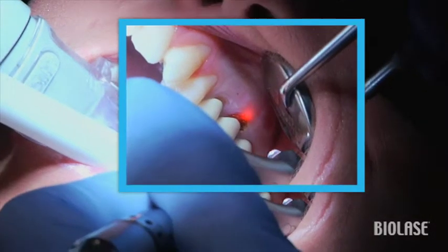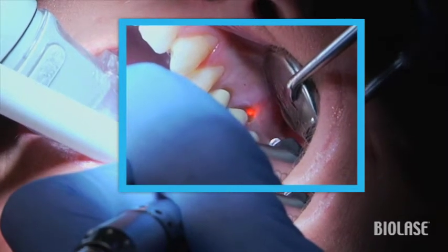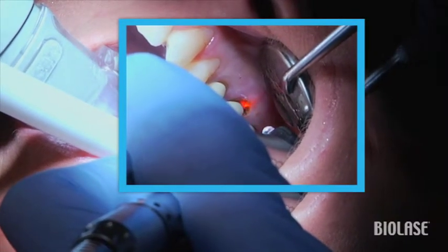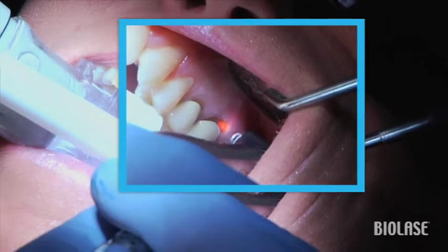After exposing the decay, I used the Waterlase MD Turbo to efficiently remove the caries. Without an MD, you would simply use your handpiece to remove the decay. But with an MD, you can do the gingivectomy using the same technique as with the Waterlase.